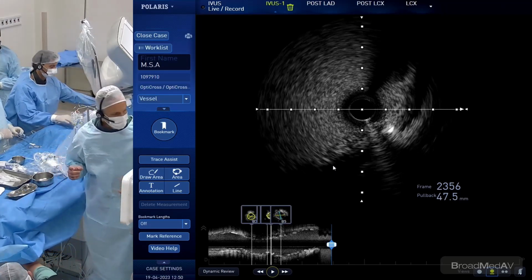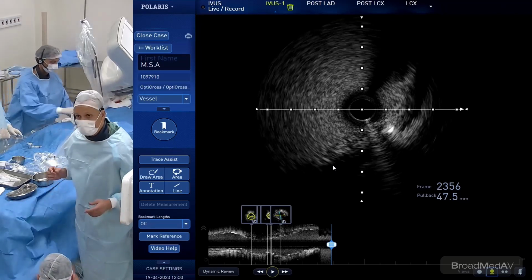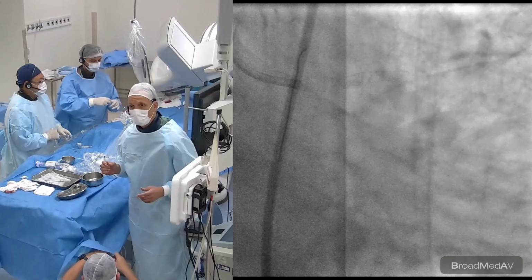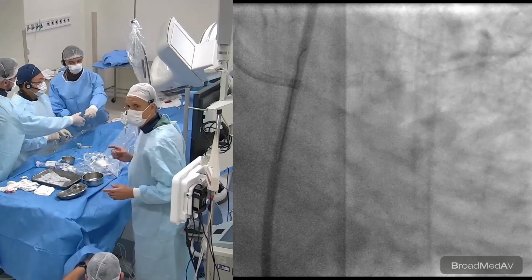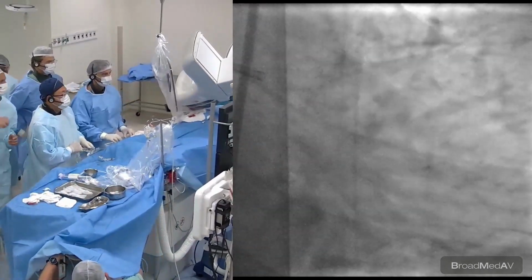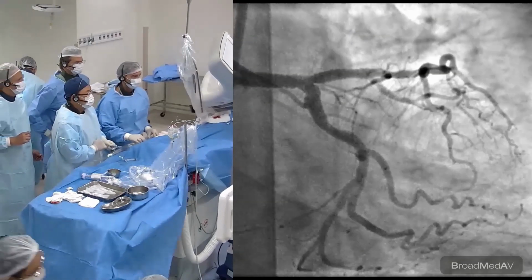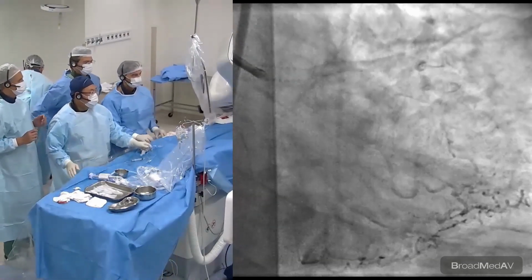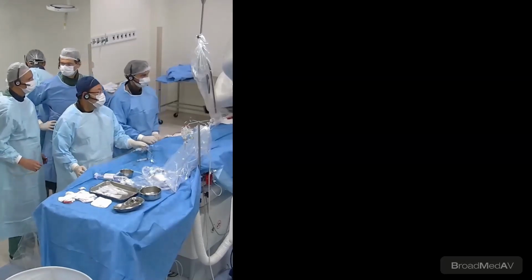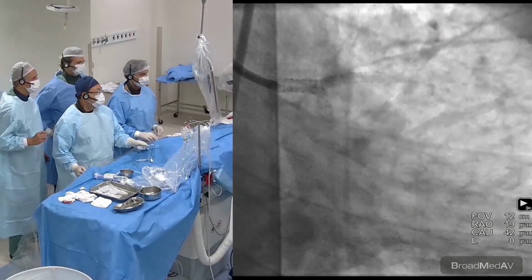Maybe we can do now the final angio. Can you go back to the angio, please, in the big screen? Great, thank you. Okay, remove the wires. Actually, angio is a little bit worse than IVUS. Do you agree with this? I think it was a very, very acceptable result.